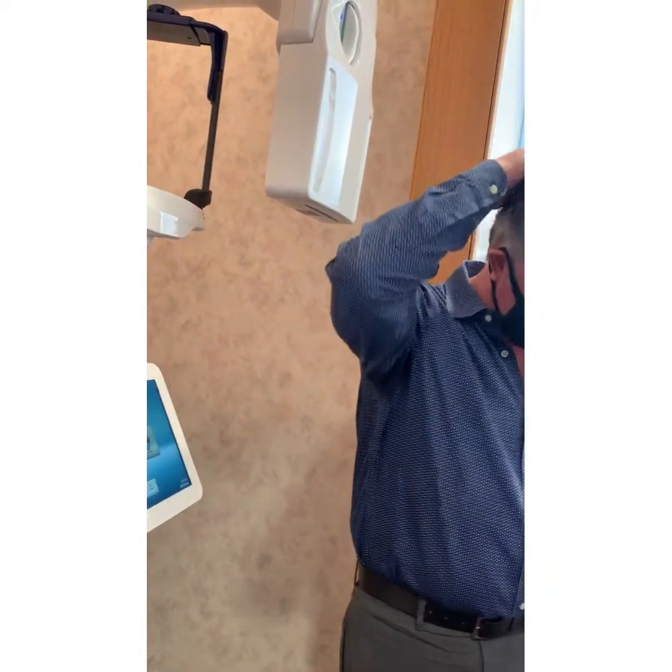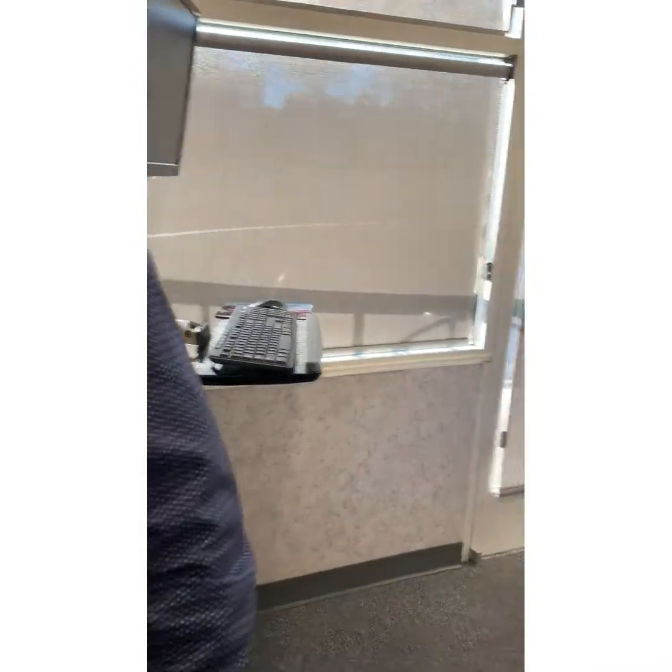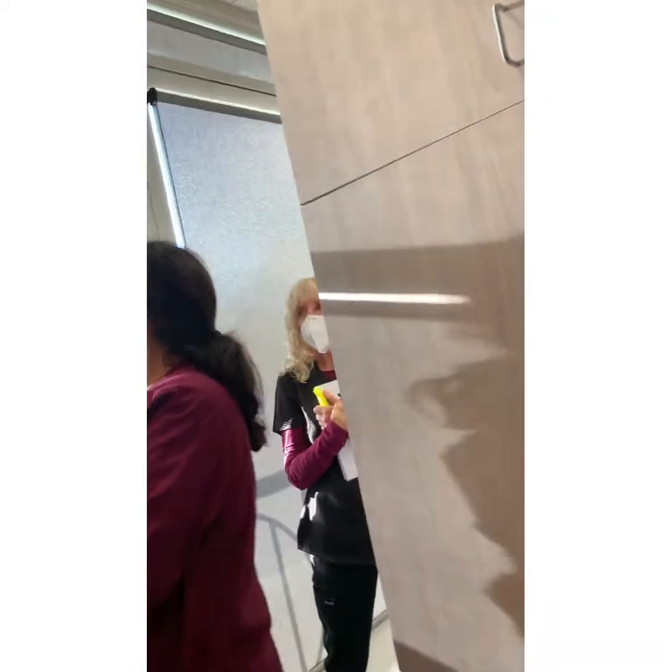Accommodate the curvature of the spine, prop their legs up, lower the machine all the way down, tilt their head in so you get somewhat of a diagnostic image. Can I ask you a quick question? Just curious, will it still work even with this little top piece on? Can we just take that off? Will this bend enough? Or do these move at all? Does it go like this? They don't? Oh, these are permanently in here. Okay, as fixed. Got it.